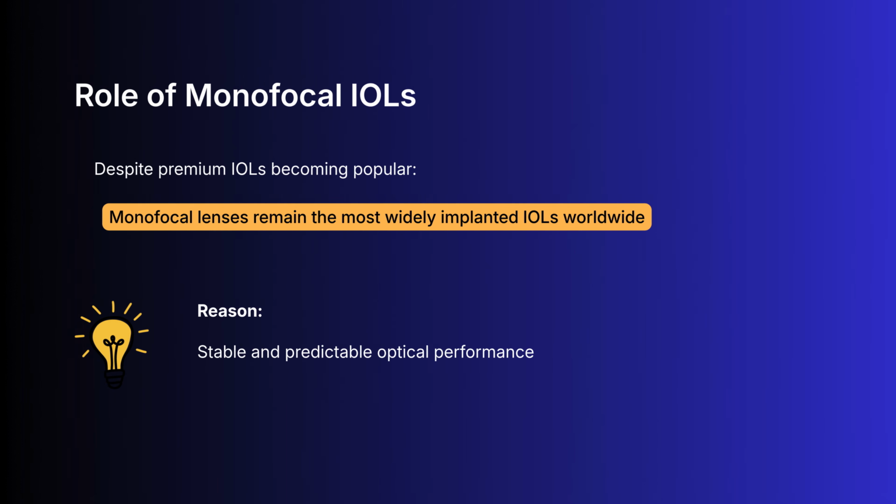Now, even though premium lenses like multifocal and EDOF IOLs are increasingly discussed today, it is important to understand that monofocal lenses still represent the majority of implants worldwide. The reason is simple: they provide stable, predictable, and high quality optical performance. More about that in a while.